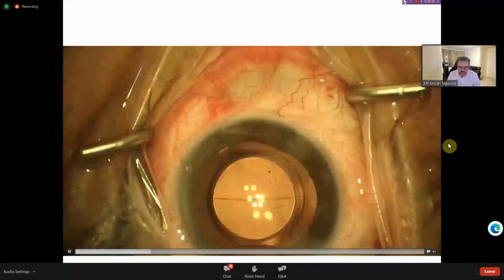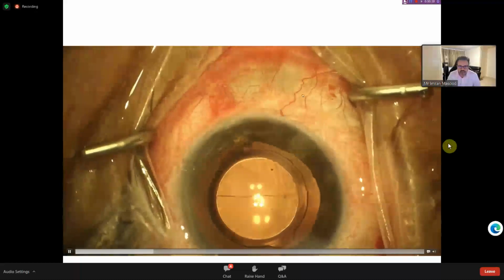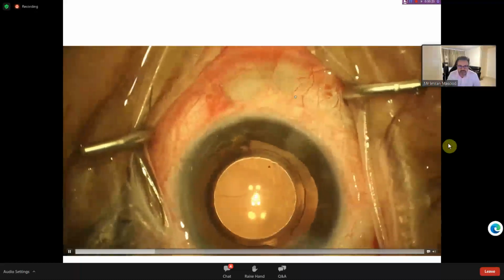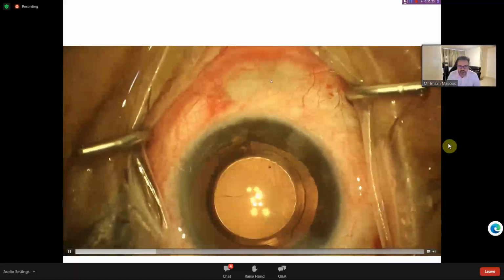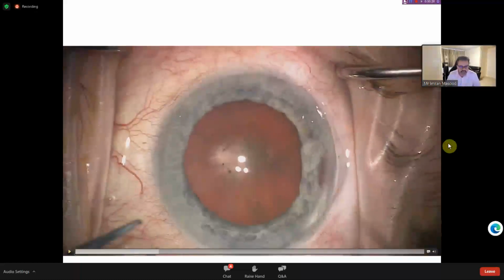And then you've got another one here. You wash away the blood, and you can see that they're very nice. Now, how else do I know that these stents are perfectly placed? If you look around here, this is the episcleral vasculature. When I inject BSS, you can see the whole area has become blanched. So this, for me, is an excellent endpoint, and I'm just going to pause here. This is an excellent endpoint to tell you as a surgeon that you've hit the spot. And in that kind of patient, I know I'm going to get a good result.